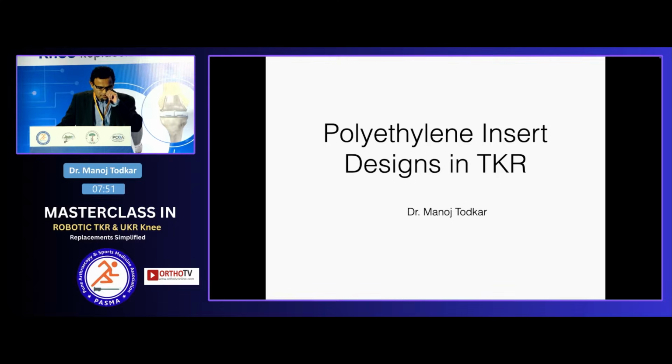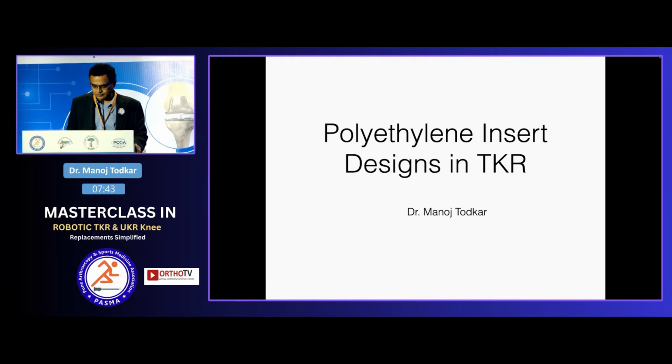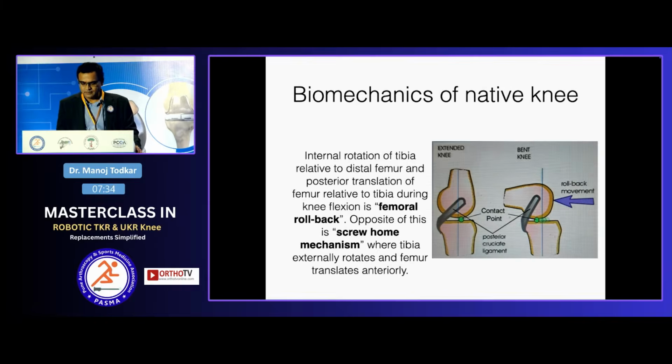Mechanics, and Kunal has given us an idea about the implant designs. So I am going to talk on inserts in TKR. Modern poly inserts are designed to recreate the native joint mechanics.